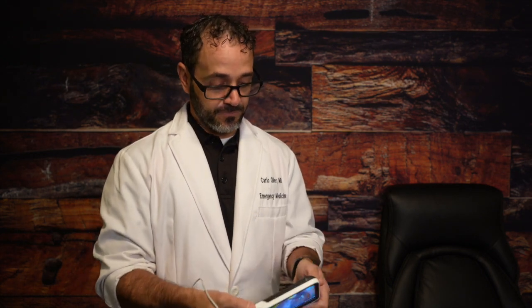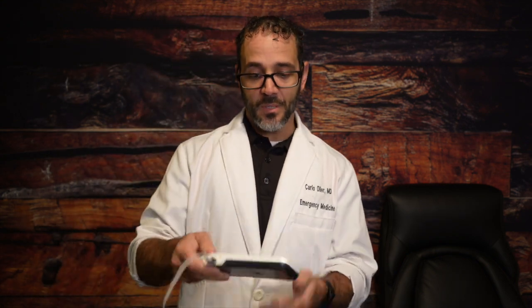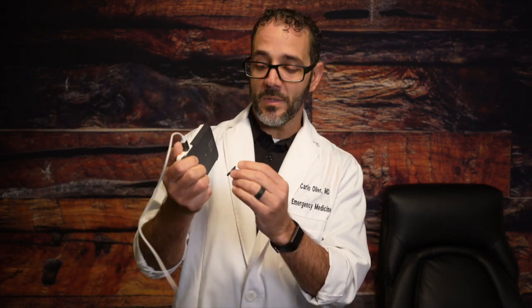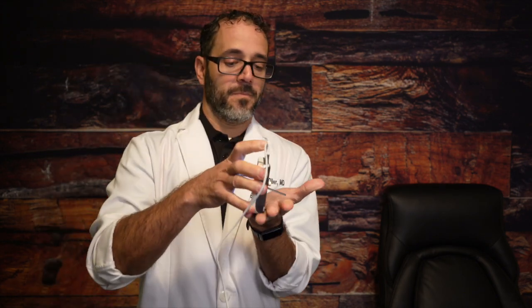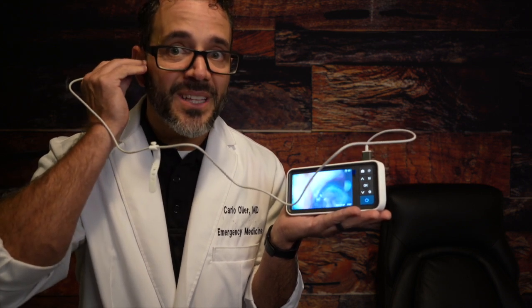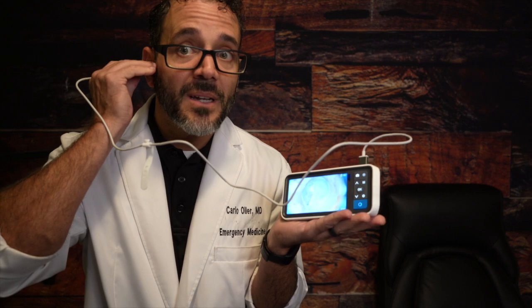So the image quality is truly superb, feels pretty sturdy. Hey, I know a cool feature. If you don't want to be holding this on your hand as you're doing the procedure, you want to put it on the table, but there's no way to hold it. There's this little screwing device, and you just do that, like so, and it basically puts like a little leg, so when you lay it on the table, it's just sitting there while you do your views of the ear membrane. Look at that, bam, how cool is that? Just like that, you get a full view of the tympanic membrane and everything. Of course, I don't absolutely know what you're looking at right now, but look at that, it's awesome.